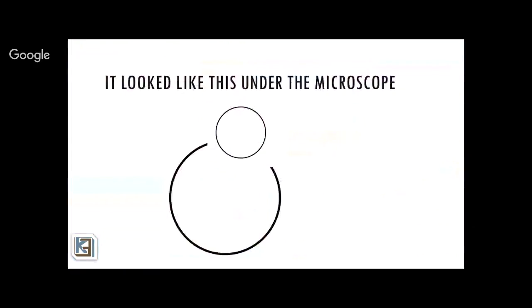Now, the problem with using the Robox is that 100 microns is not good enough for me. As I was drilling through the guide, after I removed the guide, placed the dental dam, and looked under the microscope, this is where I found my canal. The burr marks, or the drill marks, looked like this, and I had already started deviating, but the canal was on the facial of my drilling path. So if the canal was deeper, if I did not stop and check before, and I had continued going deeper in that same path, there is more deviation. I may miss the canal, and I may end up perforating.